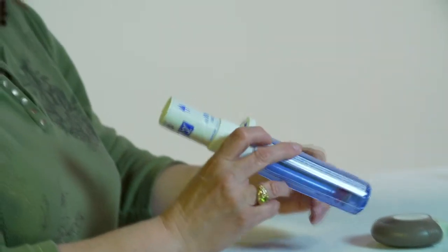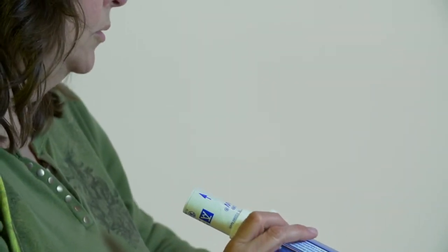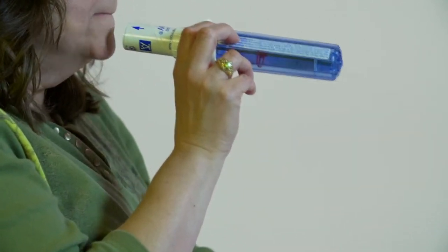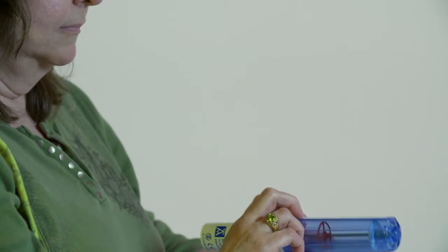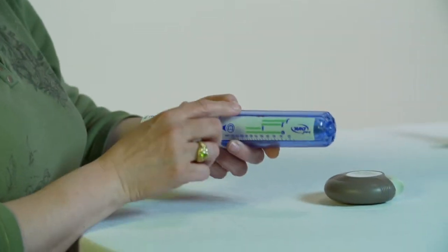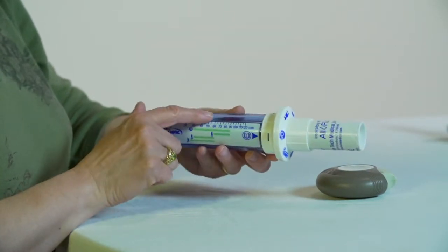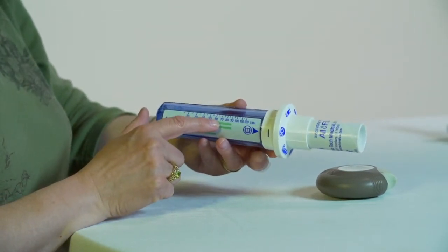Exhale deeply and create a tight seal with the lips around the mouthpiece. Inhale at the rate you think is desired for the Diskus device for about two to four seconds. Check the red indicator to see the inhalation rate actually achieved. Ideally, it should be within the optimal rate for the Diskus device, which is 30 to 90 liters per minute.